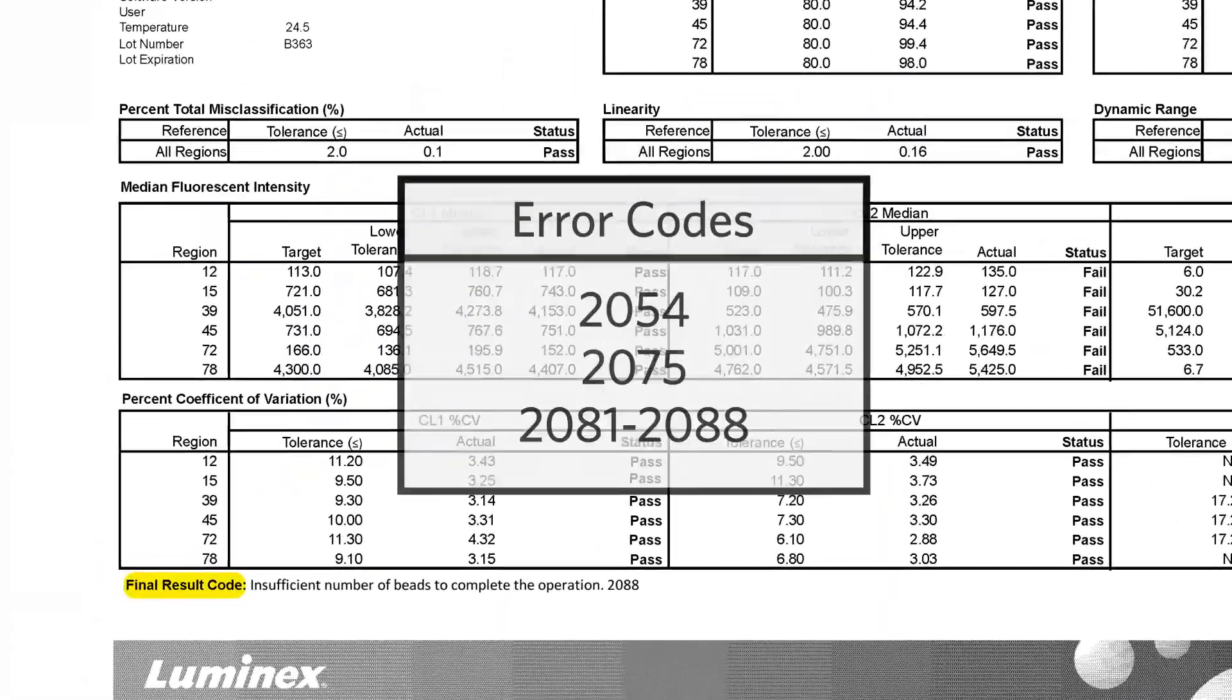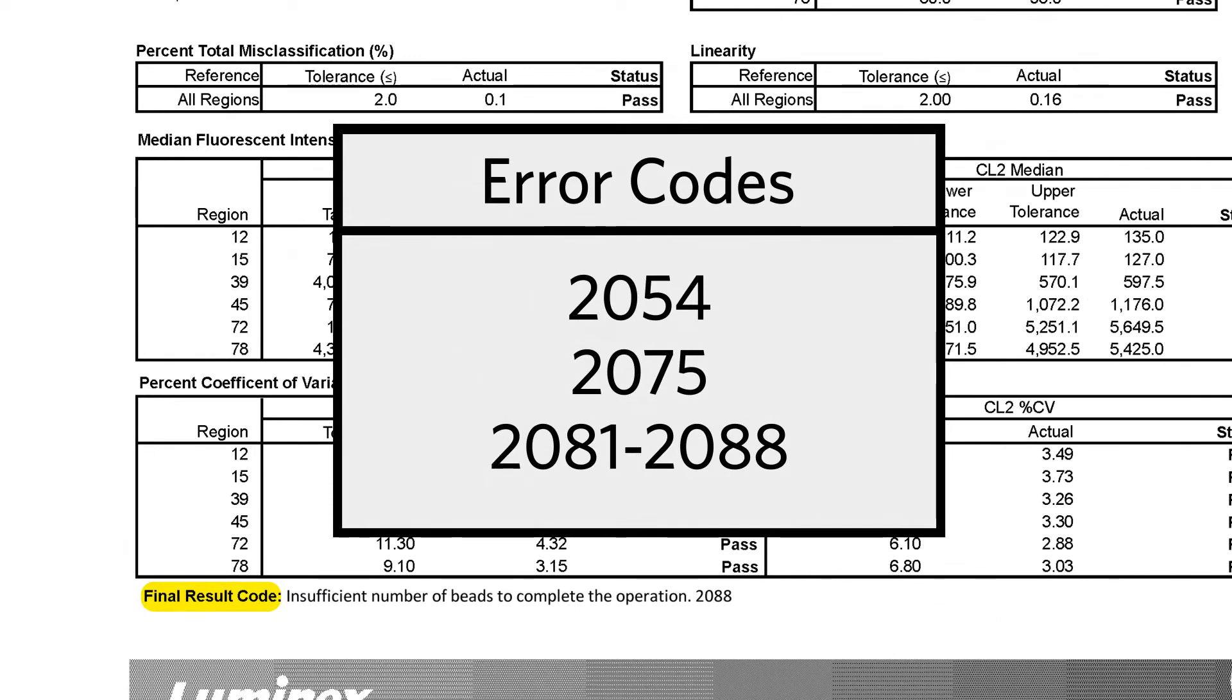Look for errors 2054, 2075, or 2081 through 2088. Often, when these errors are found in the Calibration and Performance Verification report, it indicates a probe issue.